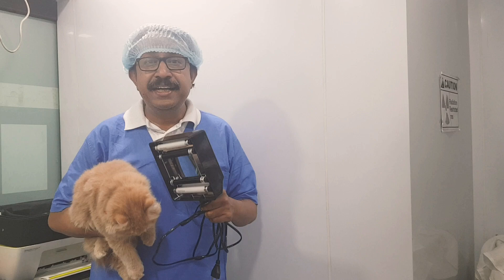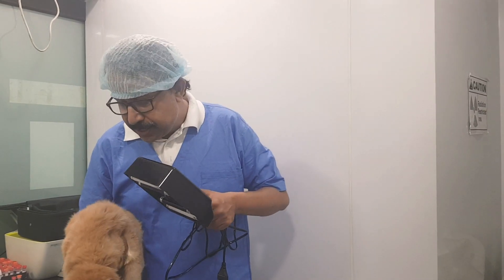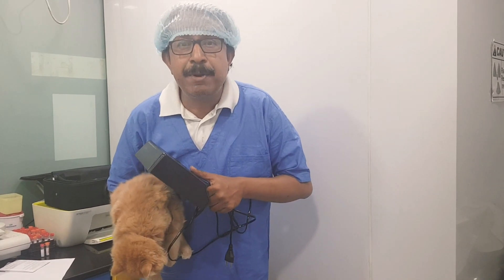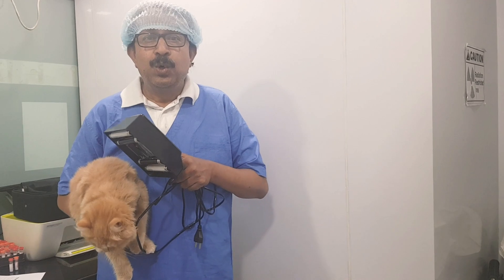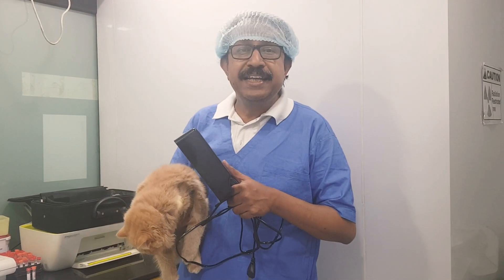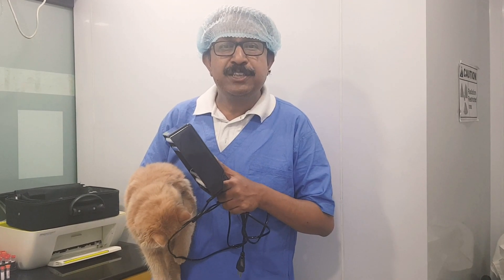The animal should be placed in a dark room and made comfortable. The light should be held over the suspected lesions for at least three to five minutes, because some dermatophytes are slow to show apple green fluorescence. They glow in the dark with an apple green color — that is how we identify the dermatophytes.